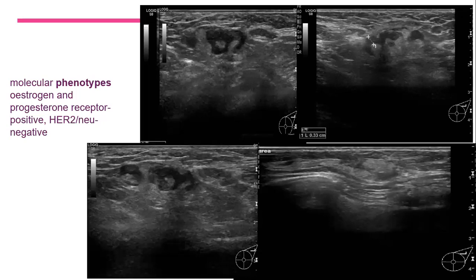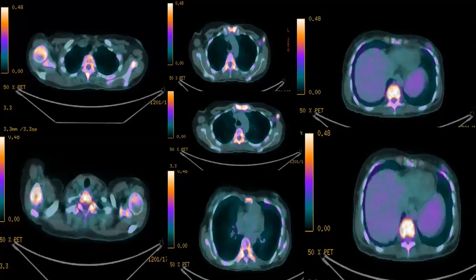And then after that, and also 3 or 4 times for radiologists, they tried to do searching for the breast lesions on ultrasound, but they could not appreciate. Okay? And based on this result, they sent the patient for PET scan.